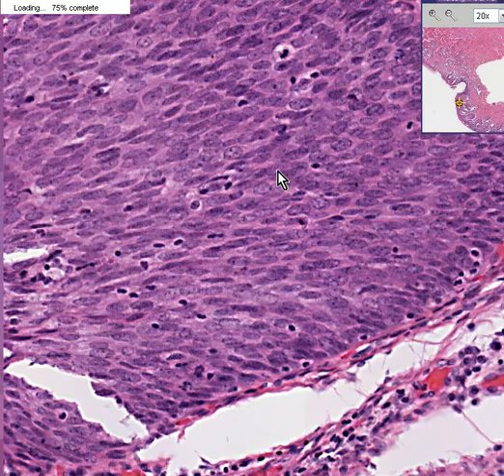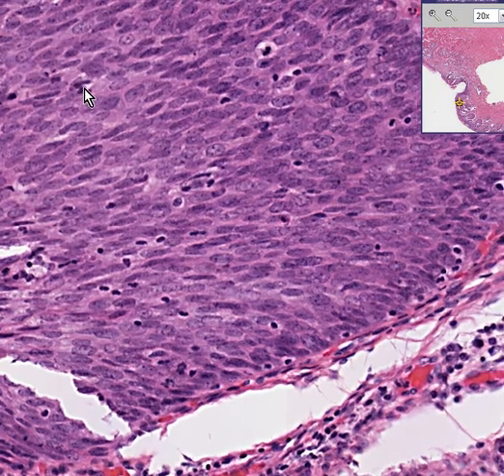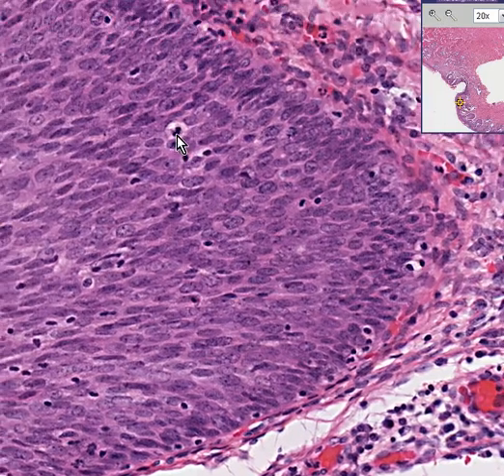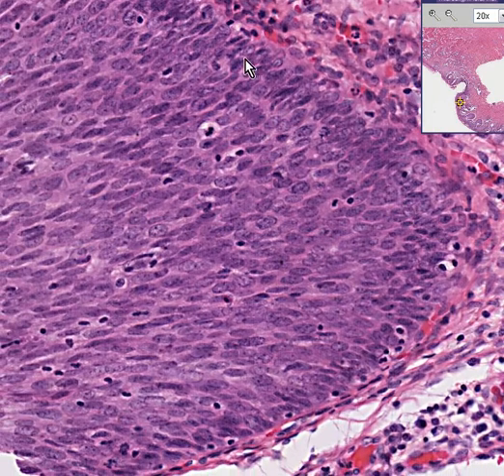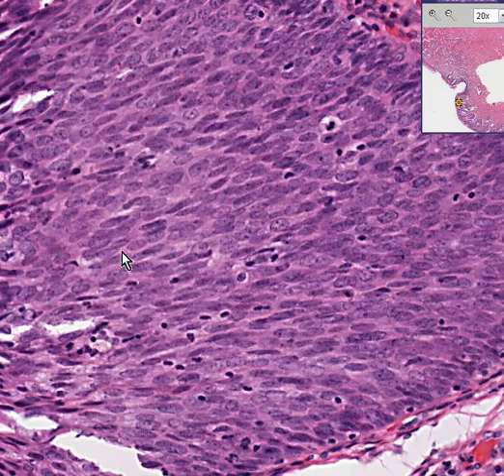First of all, you're seeing more mitoses, like here, and here, and here, and here, and here, than you should. In addition, some of these mitoses look sort of abnormal, like not bipolar, but maybe tripolar or abnormal. In addition to that as well, there appears to be absolutely no maturation between the basal surface and the higher surfaces. This is a maturation loss. All of these are typical of severe dysplasia.